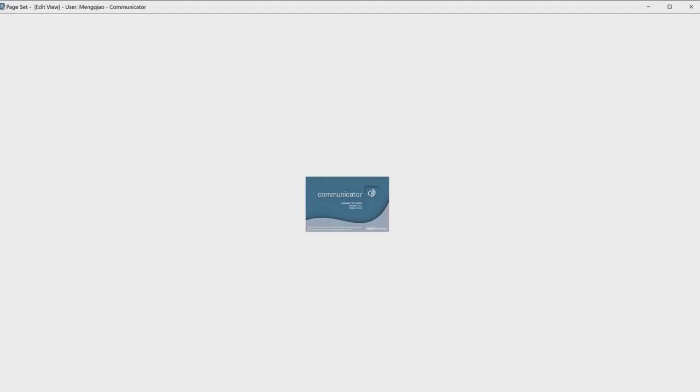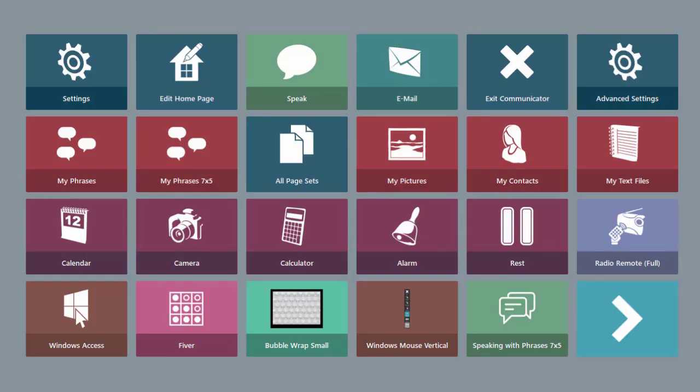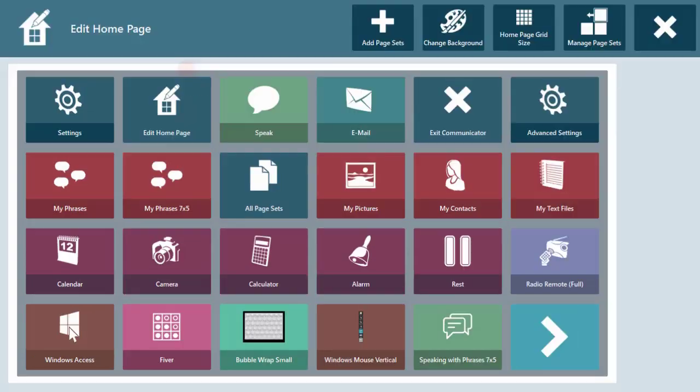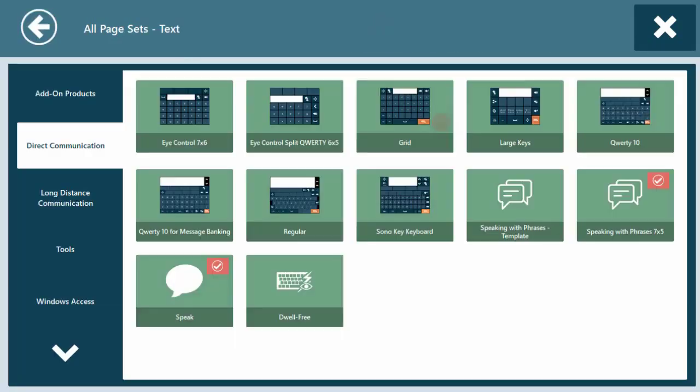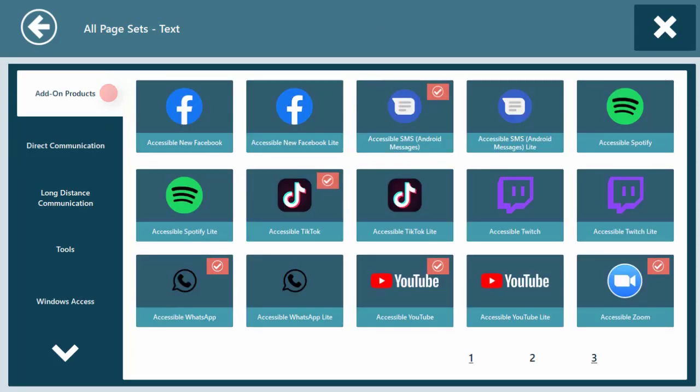After launching Communicator 5, select Edit Homepage, select Add Page Sets, then select Text Communication. And finally, select Add-on Products.